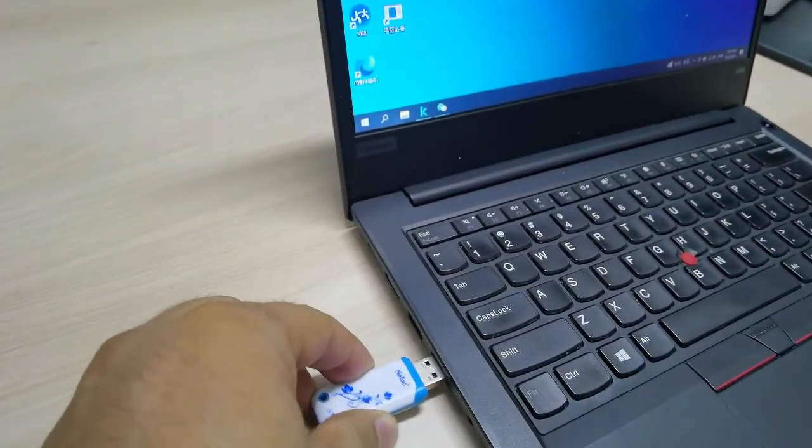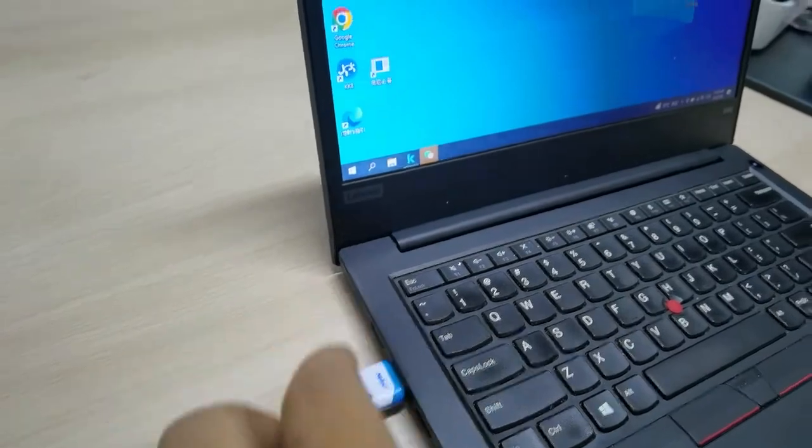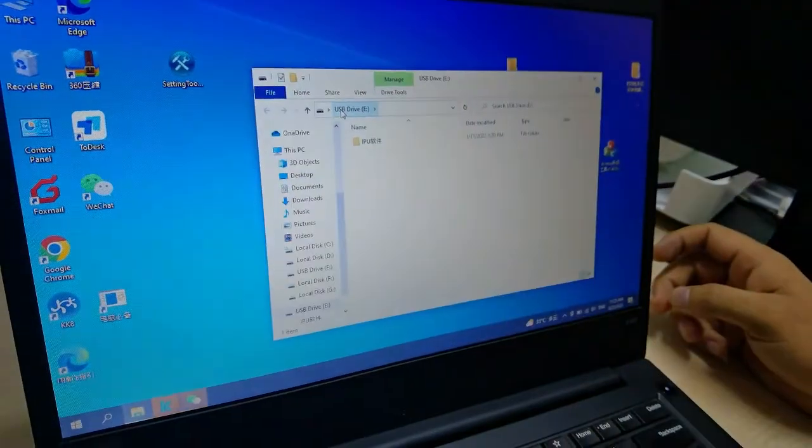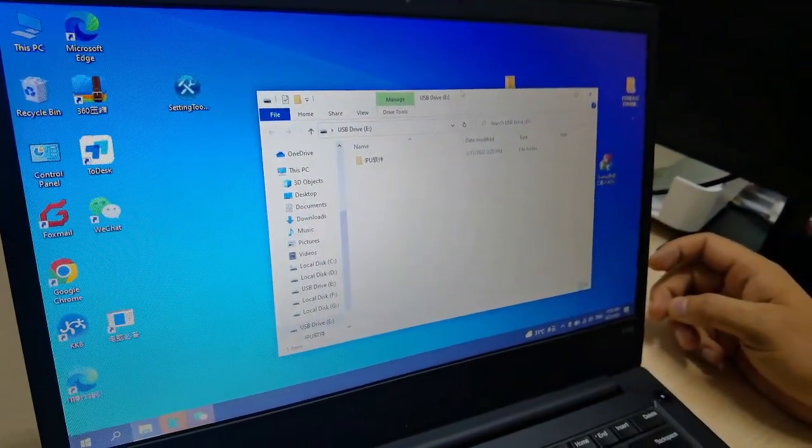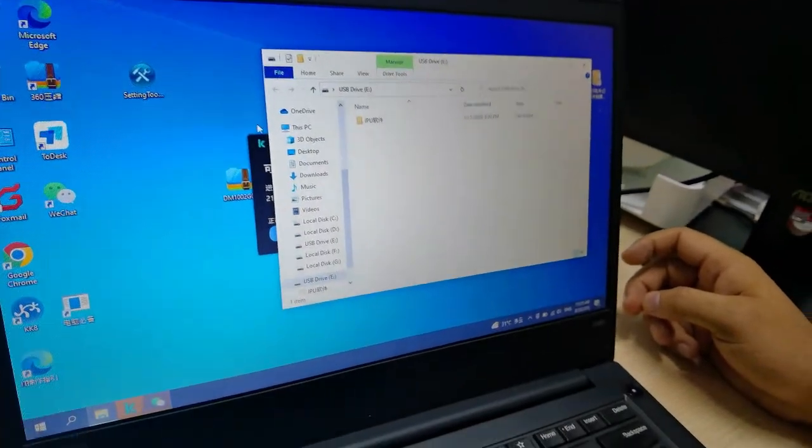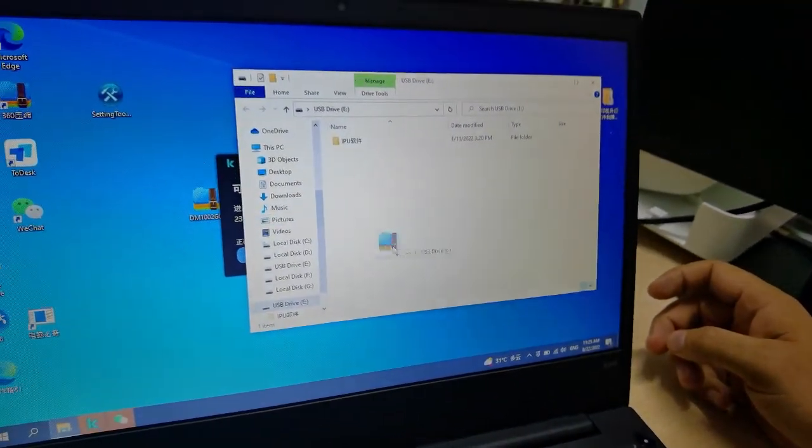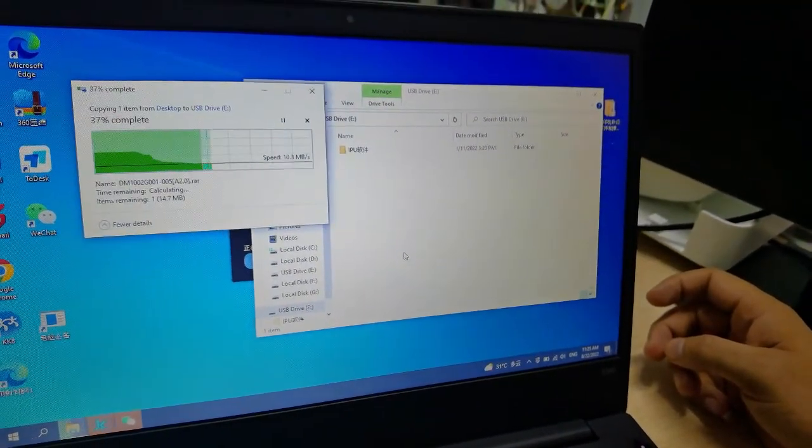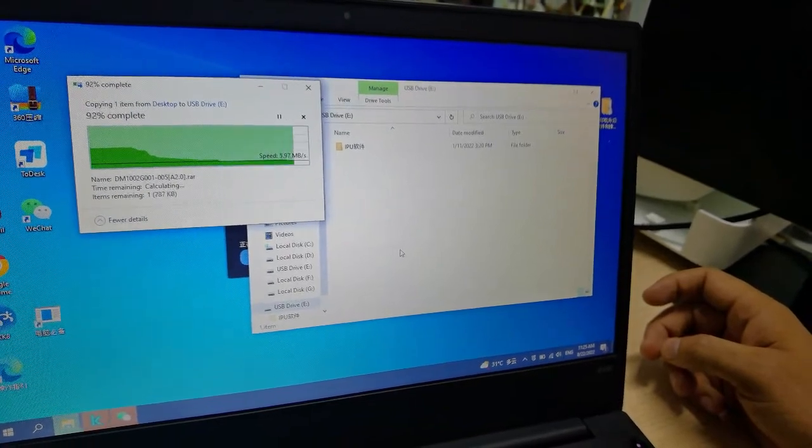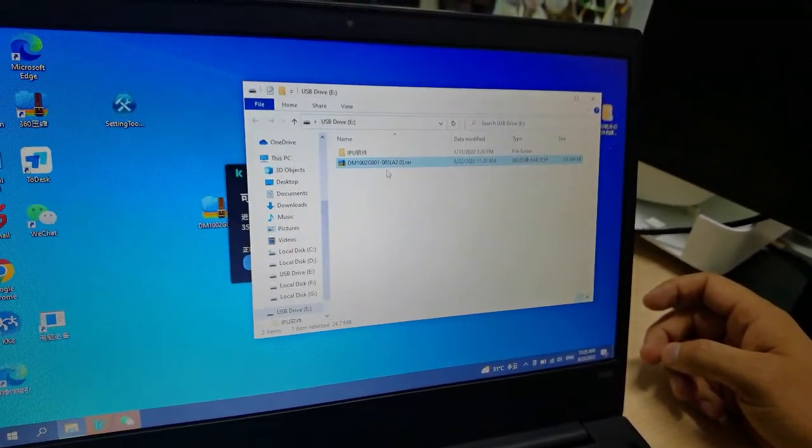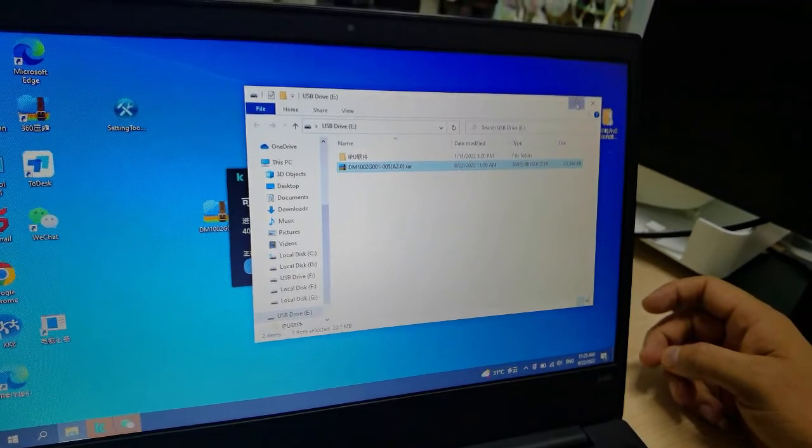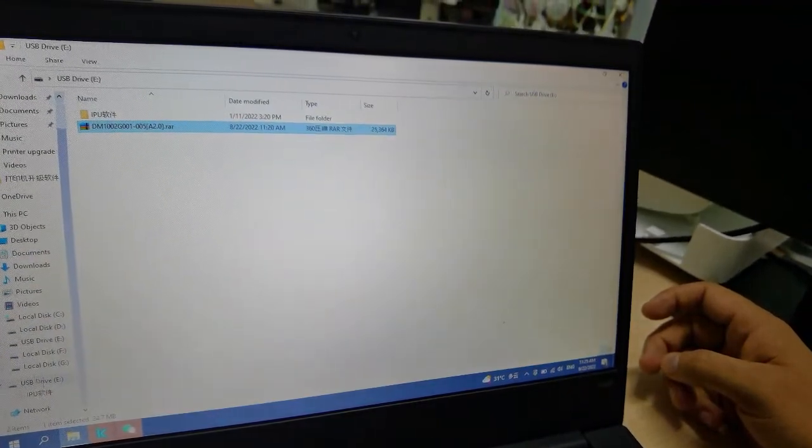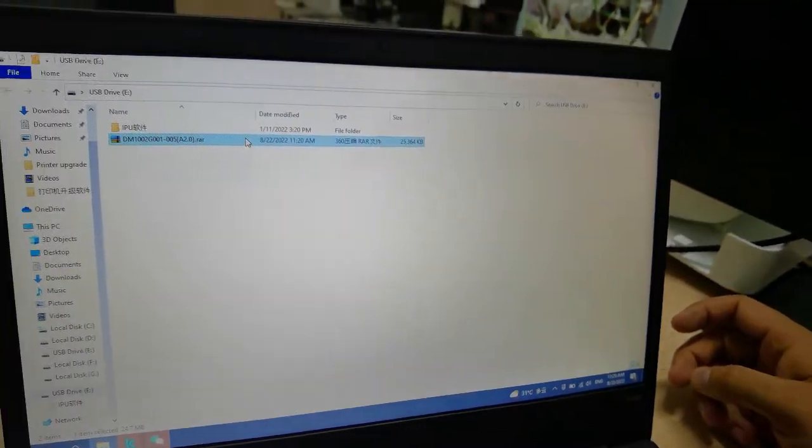You can connect it. Now my flash drive is connected. This is my flash drive as you can see. Now this is the software I will send to the flash drive. Now this software zip file is inside my flash drive. You can see USB drive.